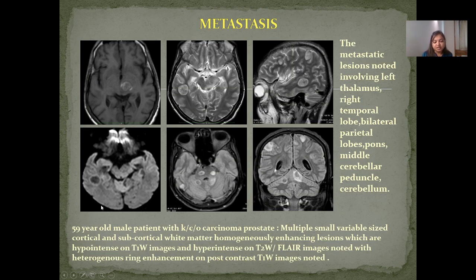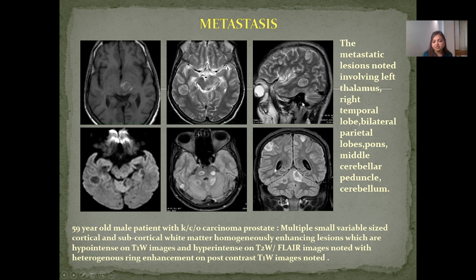Case 7 — Metastasis: 59-year-old male patient with known carcinoma of the prostate. Multiple small variable-sized cortical and subcortical white matter homogeneously enhancing lesions are hypointense on T1 and hyperintense on T2/FLAIR images, with heterogeneous ring enhancement on post-contrast T1-weighted images. Metastatic lesions involve the left thalamus, right temporal lobe, bilateral parietal lobes, pons, middle cerebellar peduncle, and cerebellum.